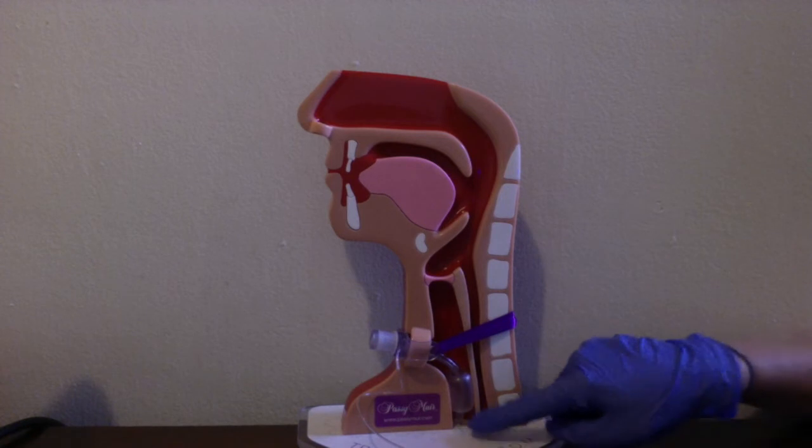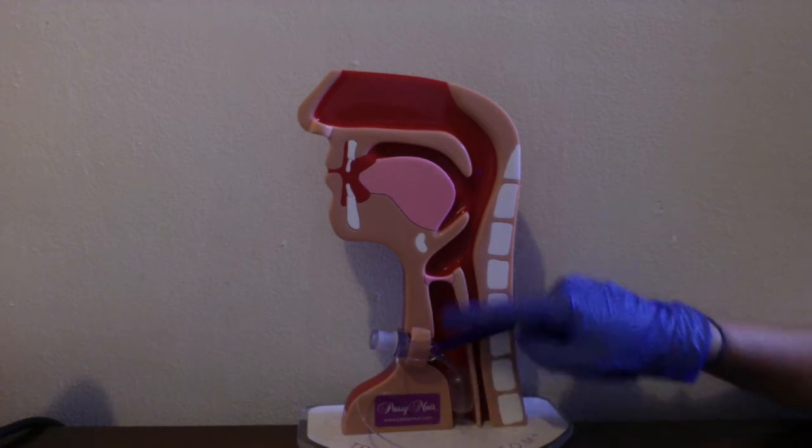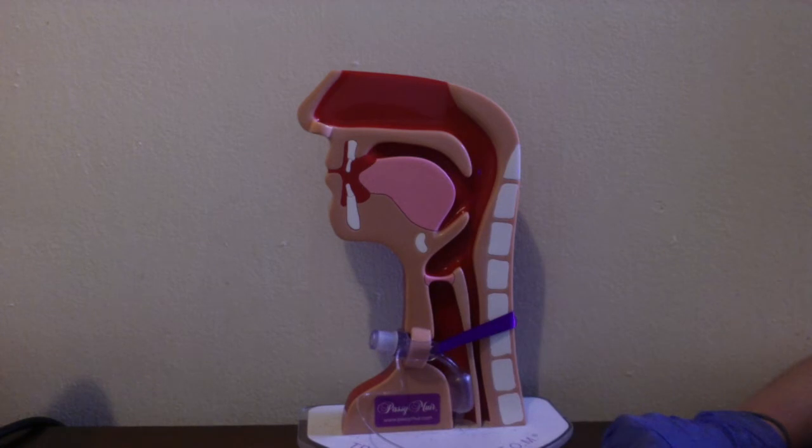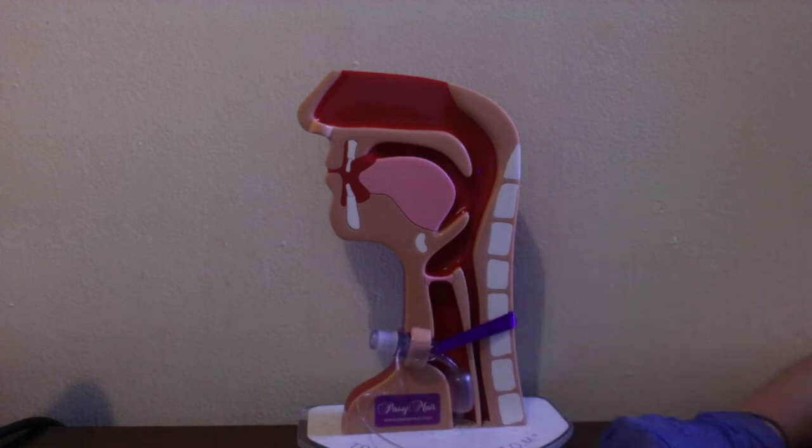When the cuff is inflated, little to no air can flow around the tracheostomy cuff and through the upper airway. Therefore, the patient will be unable to produce voicing because airflow is required through the vocal cords in order to produce vocal fold vibration for voicing.